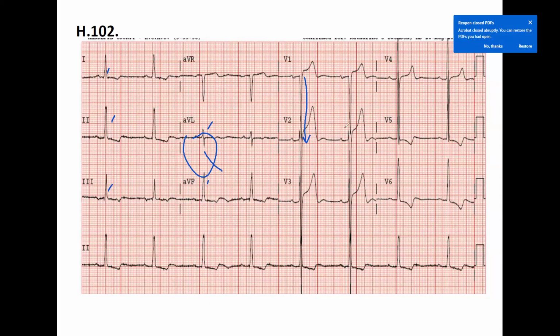We do see, however, in lead V2, V3, V4, basically we do not have it. And only one lead doesn't mean anything. So we can say no Q wave. Good. Now you can go for the hypertrophy and compare the size. I show you, this should be the end of the R wave in V5. This is the R wave in V5, and this is the S wave in V1.